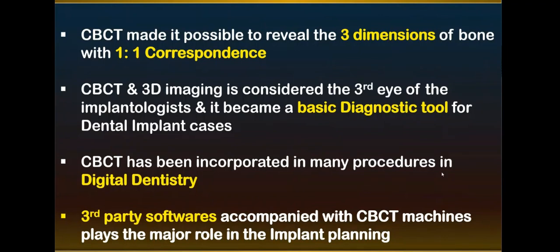CBCT is also incorporated in many procedures in the process of digital dentistry. This means that CBCT can be integrated with CAD/CAM or with photography or facial scanning. A lot of techniques can be incorporated with CBCT. The CBCT as a machine is like a capture or acquisition equipment. Also integrated with the CBCT is third-party software, which is the one that we use to display and manipulate the images and make our treatment planning.